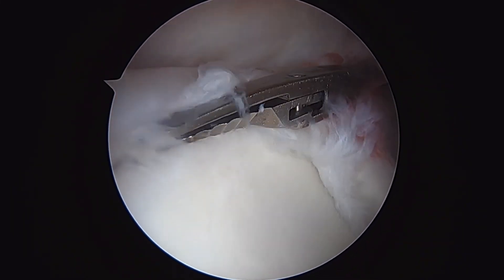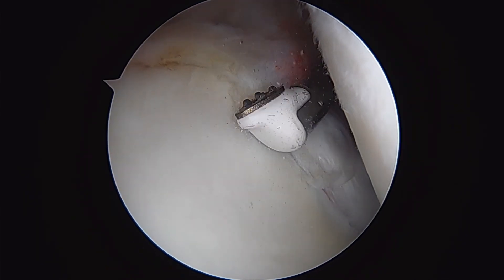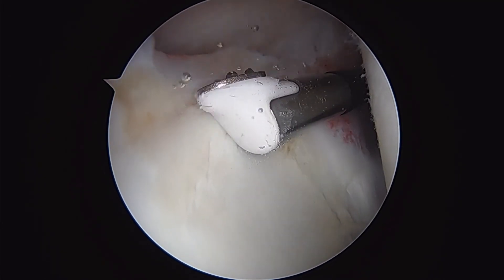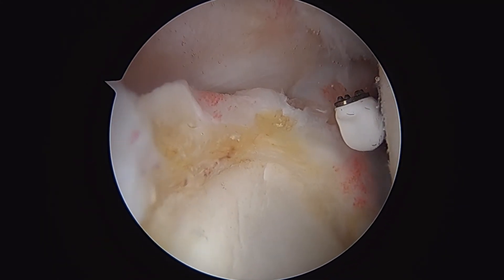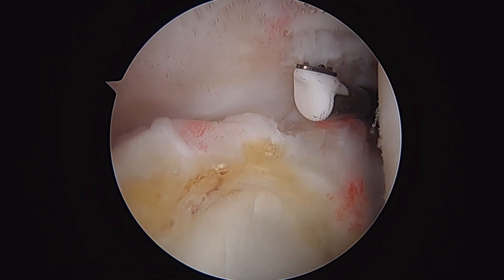There you can have a pretty good look at this SLAP tear — superior labral tear of the shoulder. This is our radiofrequency ablator, just debriding back these unstable edges of tissue to clean it up. That's a final look at the labrum there — debrided back, and that looks pretty good.